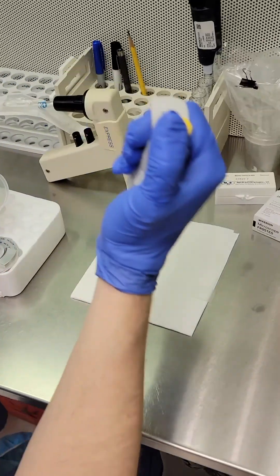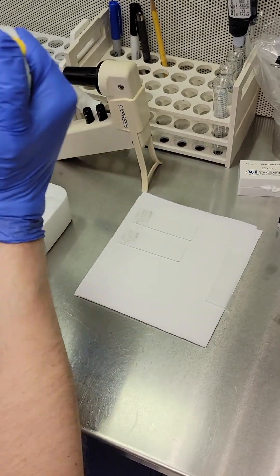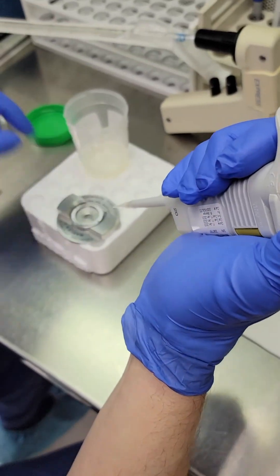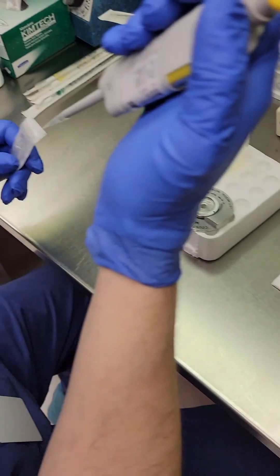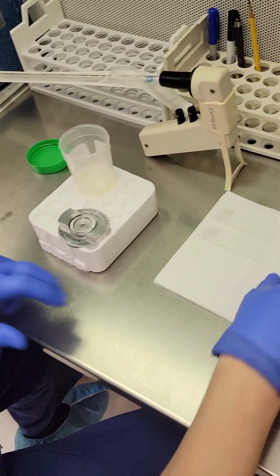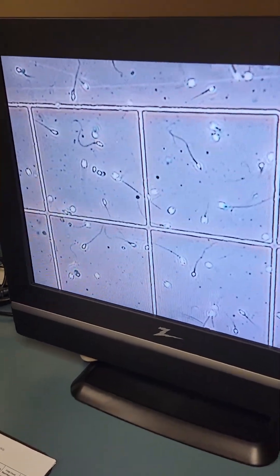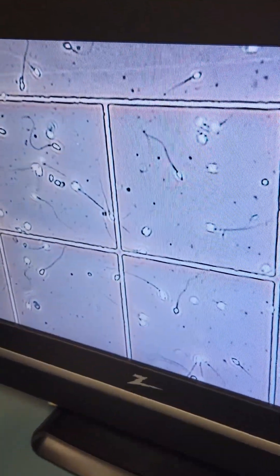Next, we put drops of the sample on slides to check out the morphology of your sperm — we'll explain what that is in a minute. And we put another drop of your sample in a chamber that goes under the microscope, and that's what gives us the detailed view of how many sperm you have, as well as how healthy they are. The microscope actually provides a more detailed view than this, but what you see on the monitor gives you a pretty good idea of what it looks like.